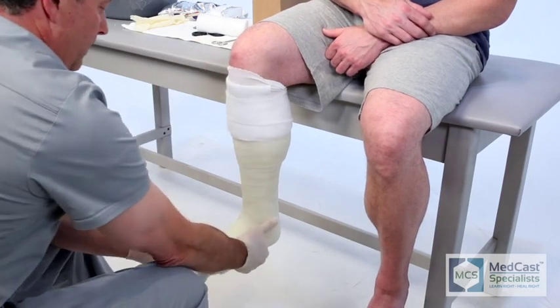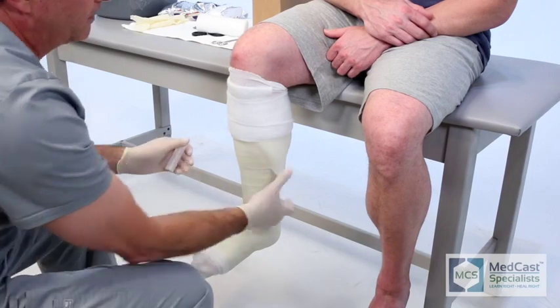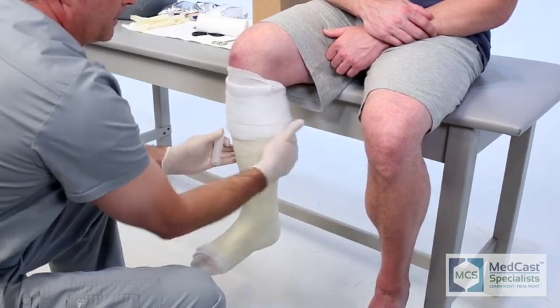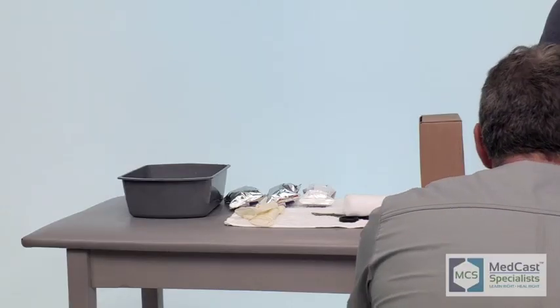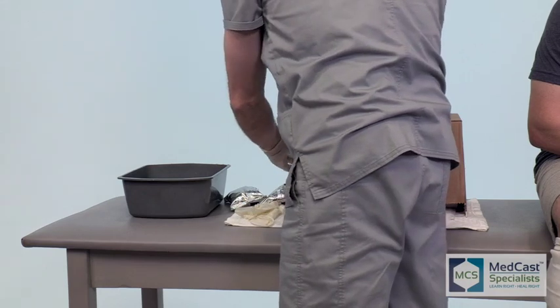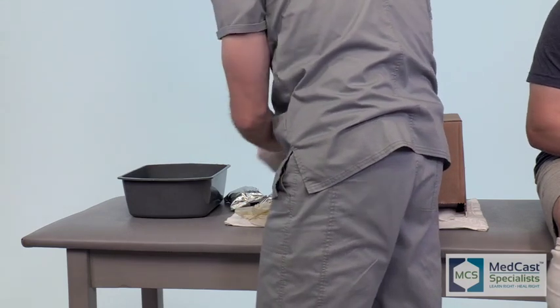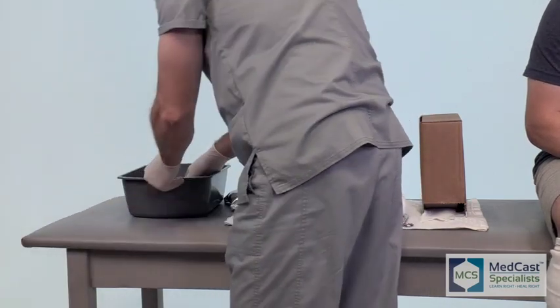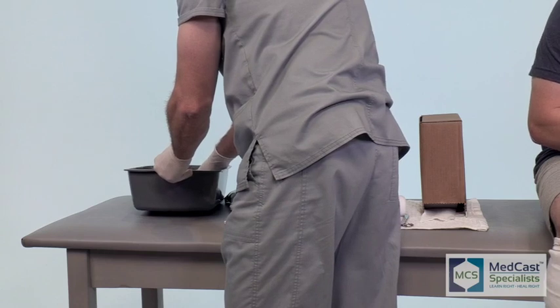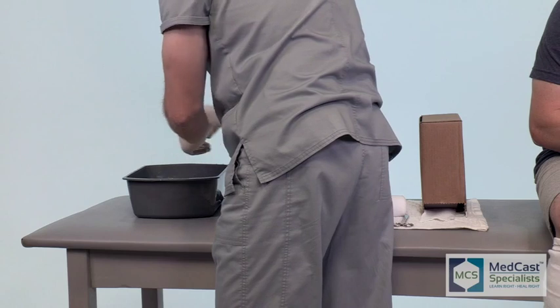As far as technique goes as you're wrapping around the foot and transitioning to the ankle and the heel, there's not really a strict technique — just go with whatever you're doing so you're laying an even wrap of cast material. You can kind of go around one side, back around, doing a figure eight, but then make sure you always check your calcaneus and make sure you've got the bottom aspect of that covered, because that's where you're going to have breakdown.